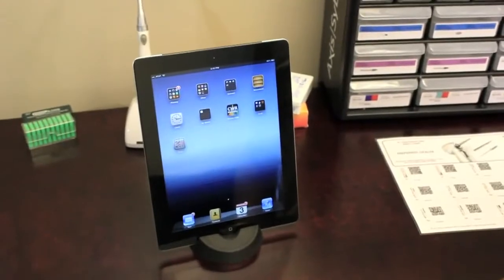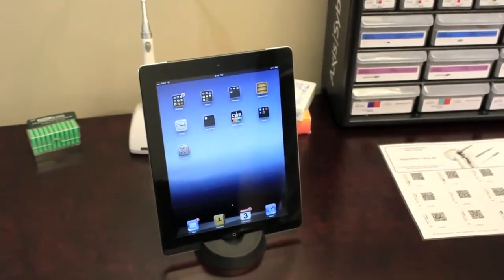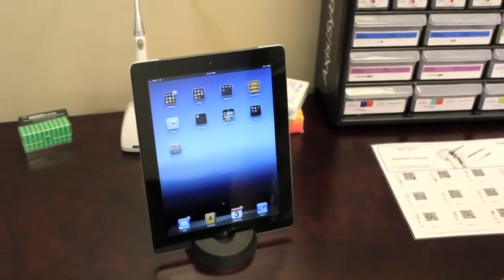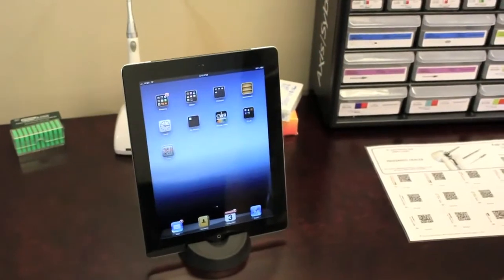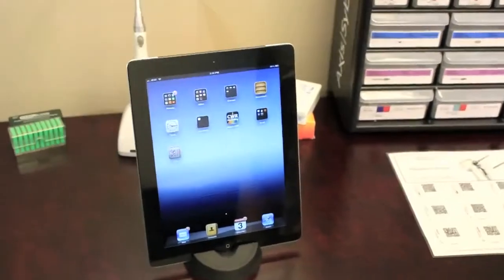To demonstrate, I'll scan an item to order to show you how simple the system is to use. Then we'll talk about the newest feature we've added that makes it even more effective.